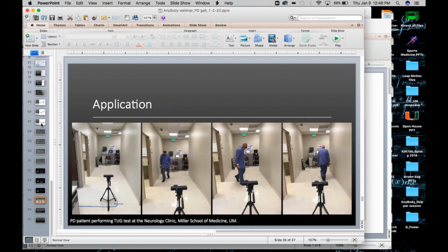But as far as fine motor and things like finger tracking or hand tracking, we have actually also been doing similar work with the Department of Neurology using the Leap Motion depth sensor, if you're familiar with it. If you look it up, it's similar to the Kinect. It's a very small depth sensor, maybe 10 centimeters long, used for hand and finger tracking.